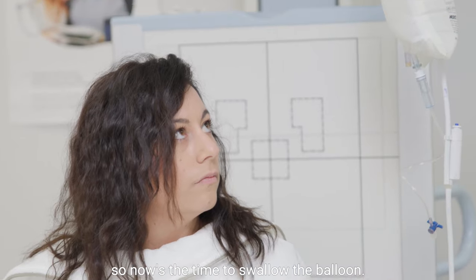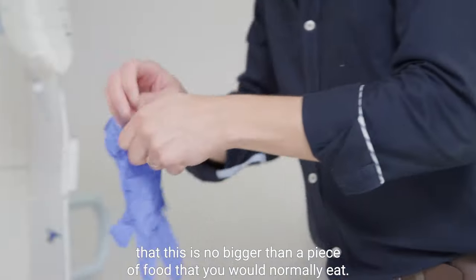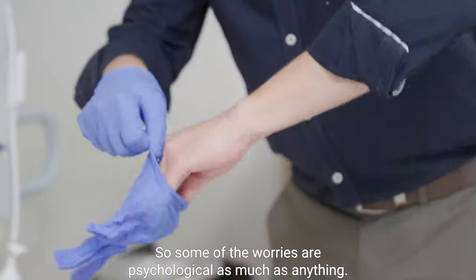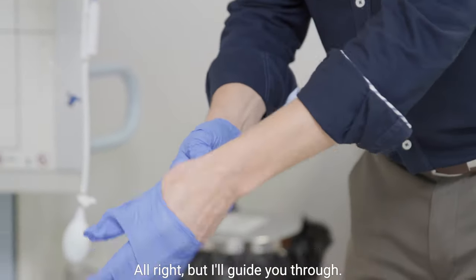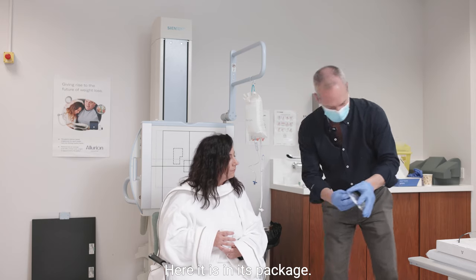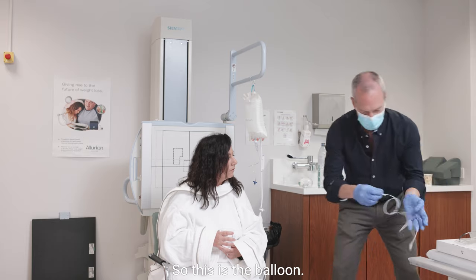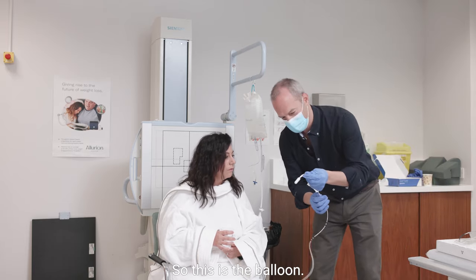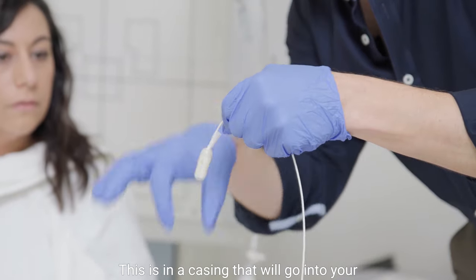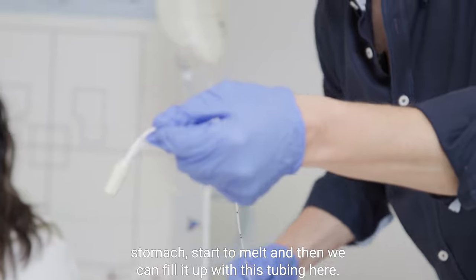Right Georgie, so now's the time to swallow the balloon. You've got to remember that this is no bigger than a piece of food that you would normally eat. So some of the worries are psychological as much as anything. But I'll guide you through. So I'm just going to show you the balloon — here it is in its package. This is the balloon, and it's in a casing that will go into your stomach, start to melt, and then we can fill it up with this tubing here.